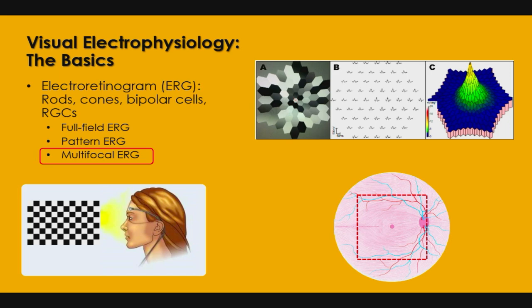Can anybody guess why the sizes of the hexagonal shapes are not the same? The clue is they get bigger as they go out. It has to do with sensitivity of the photoreceptors. You are on the road, but not quite there. It has to do with sensitivity, but there's a much more to it, convergence.